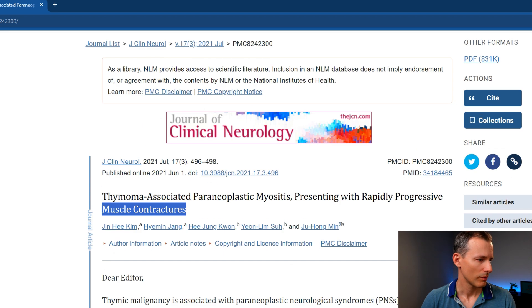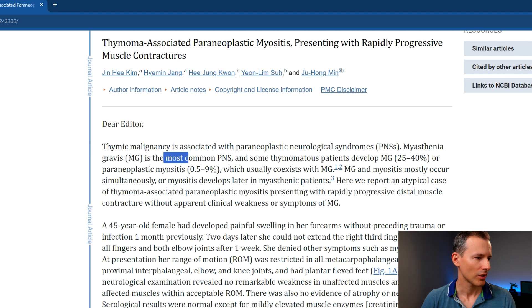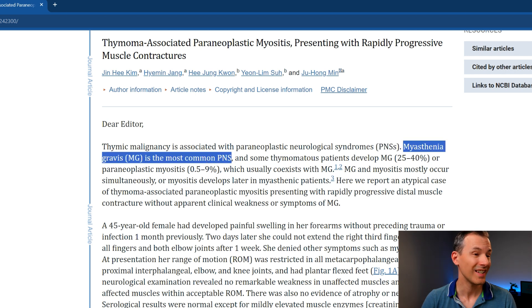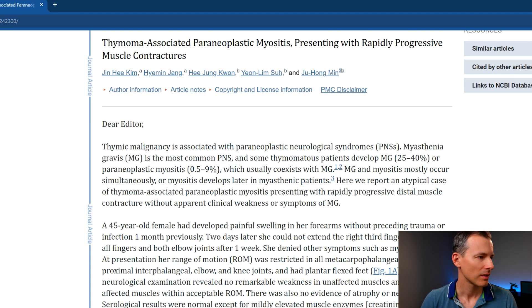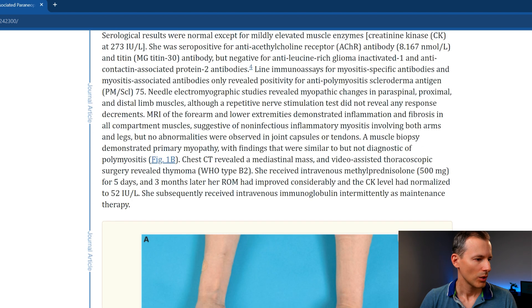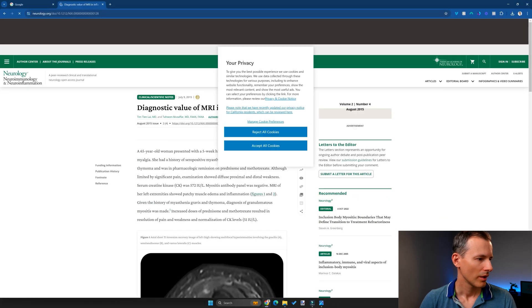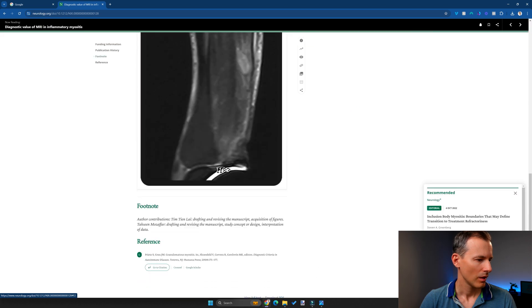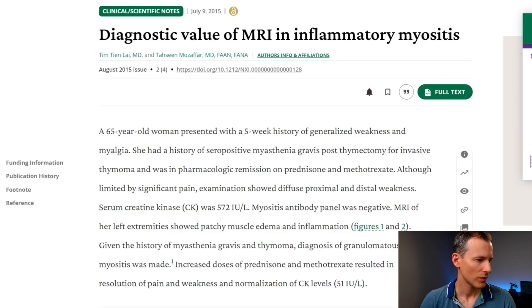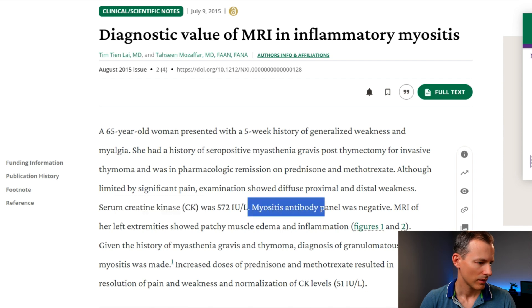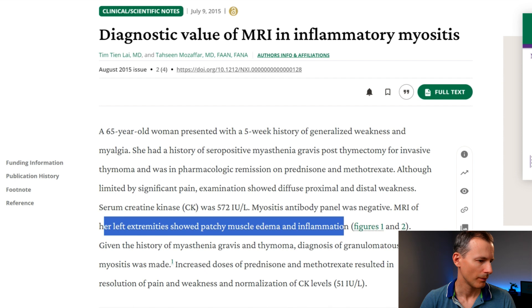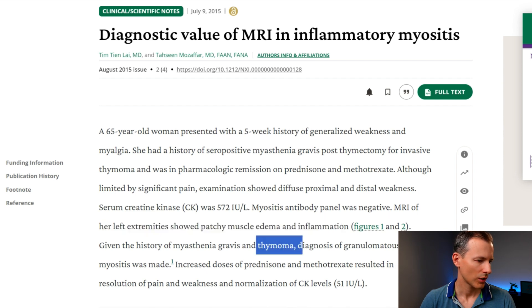I found thymoma-associated paraneoplastic myositis very quickly. We can see a case showing muscle contractures and thymoma-associated paraneoplastic myositis — so this seems to be a real entity. Myasthenia gravis obviously came up, but we didn't have any indication that was happening. I found a case with history of seropositive myasthenia gravis, post-thymectomy for invasive thymoma, who developed increased CK, myositis antibodies, and patchy muscle edema and inflammation.